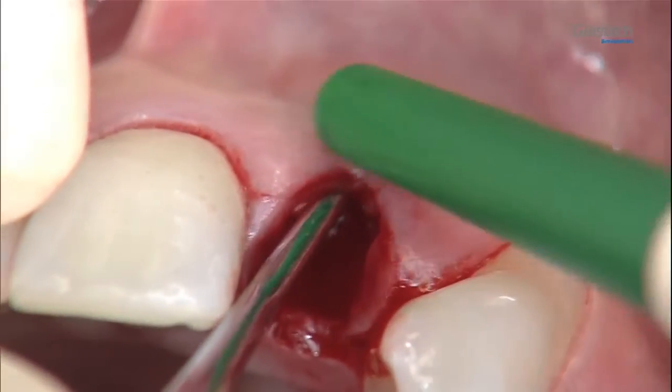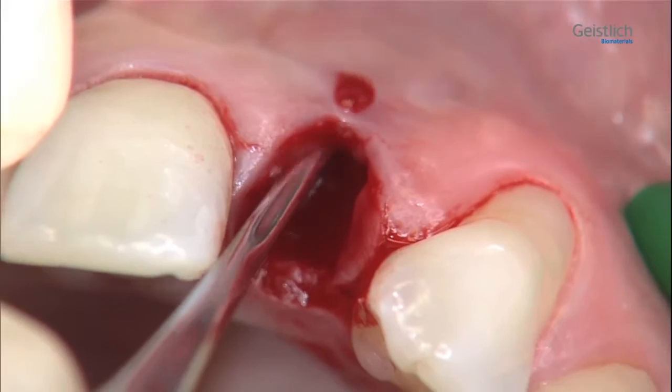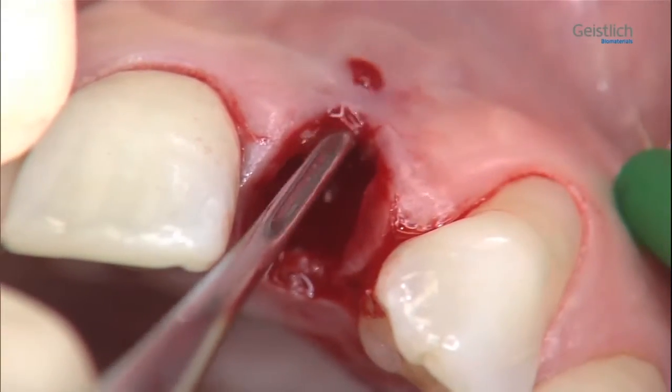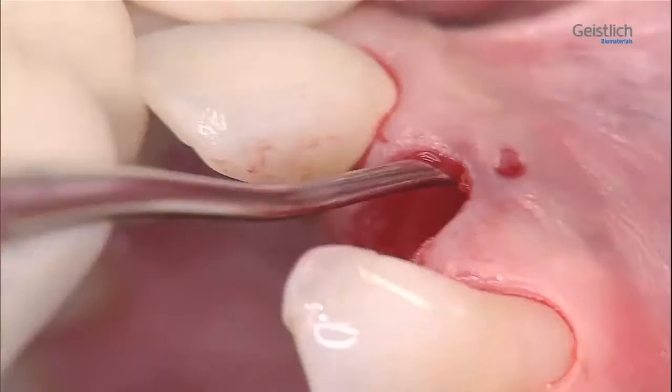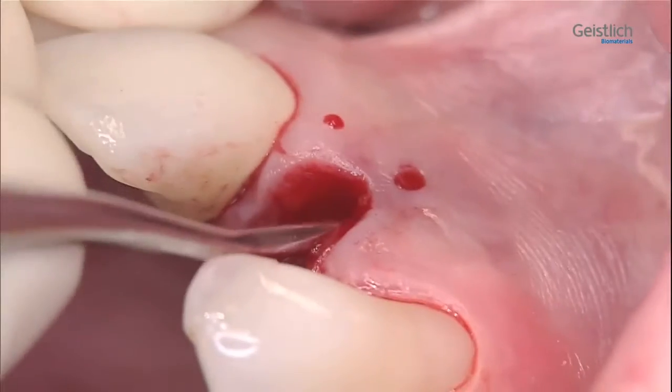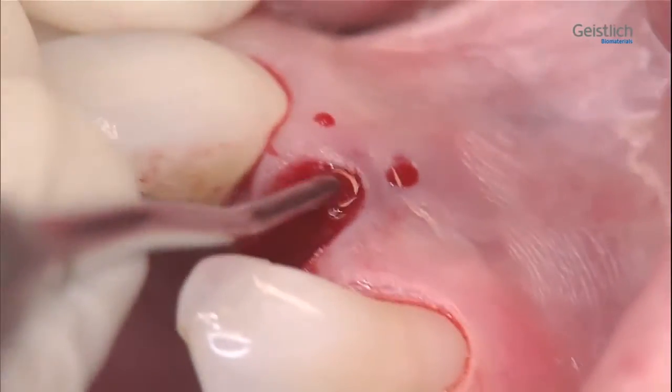Here, we can clearly see that the buccal bone plate is missing. We detach the buccal mucosa at site 2-2 and at part of the adjacent sites 2-1 and 2-3 from the bone with a tunneling instrument. This creates space for the membrane.